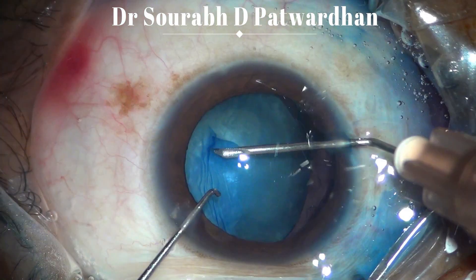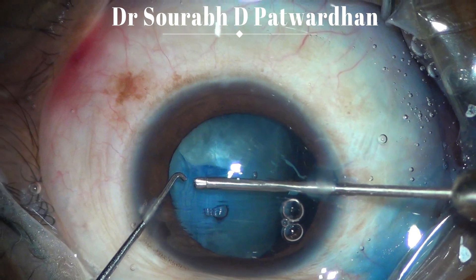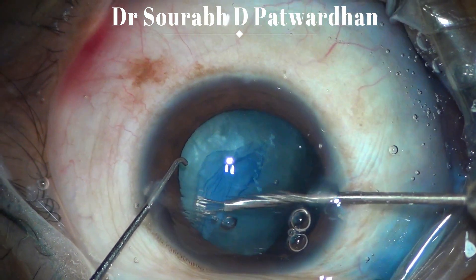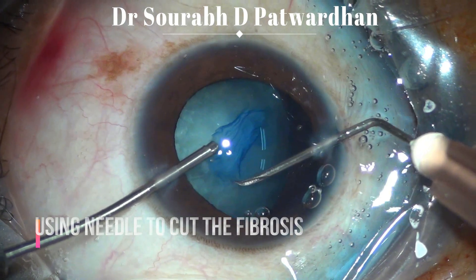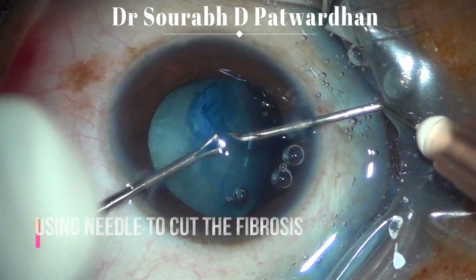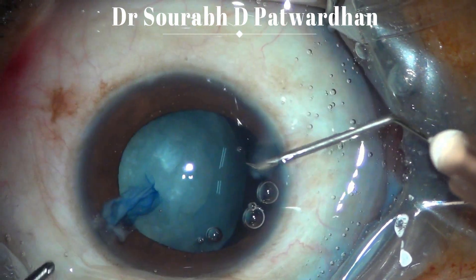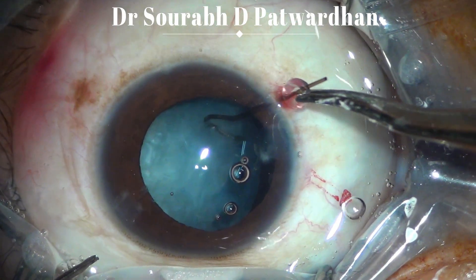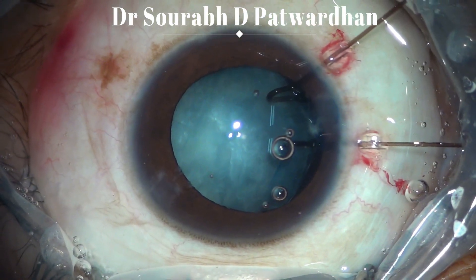The next case is a case with subluxated cataract with fibrosed anterior capsule — a post-traumatic subluxation with mature cataract. You can see the folds on the anterior capsule; it is fibrosed. Once I started doing the capsulorhexis, I noticed it ran into the area of fibrosed capsule. I tried to push it further but once it goes into that area of fibrosis I have to cut it. I am using a 26 gauge needle — you can also use scissors — to cut it, and then assisted by the 26 gauge I am completing the capsulorhexis. After putting the capsular hooks, I decided to do small incision cataract surgery in this particular case.